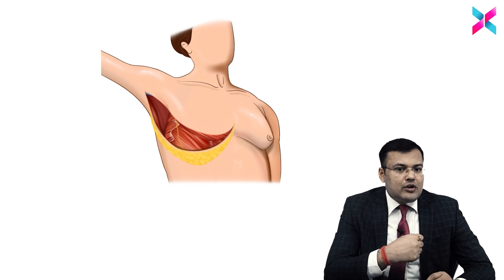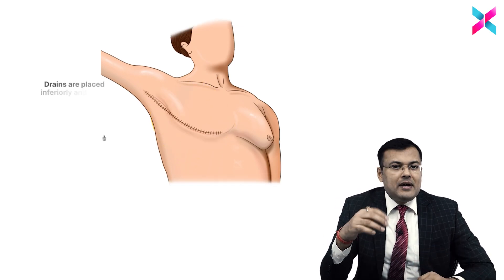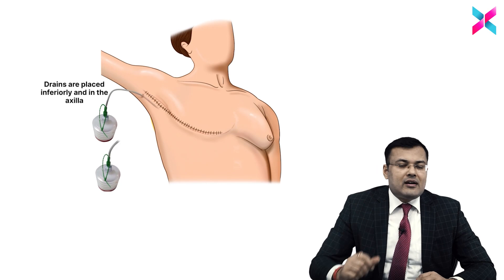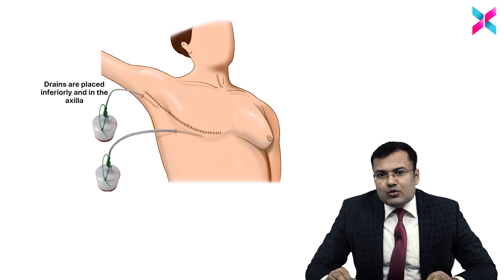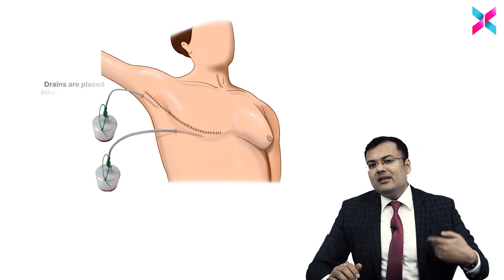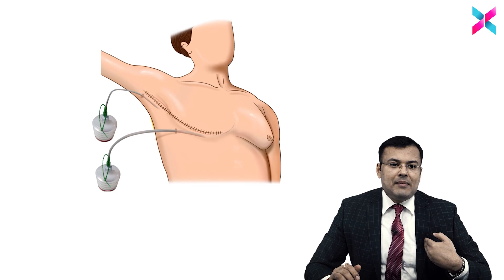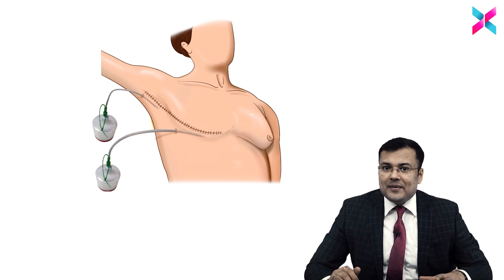Whenever lymph nodes are also removed, you are going to close the skin flap. Before closing the skin flap, we are going to insert a Romovac suction drain. One limb is placed beneath the skin flap and one limb is placed in the axilla.